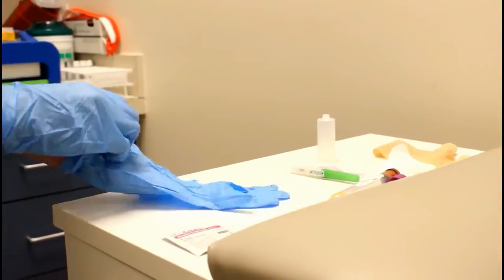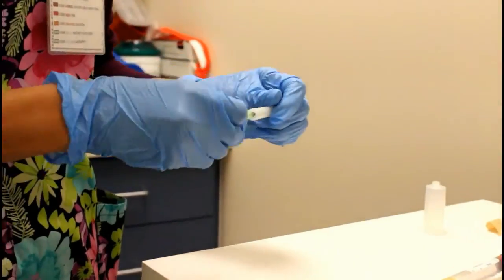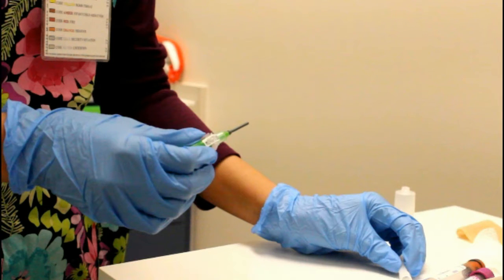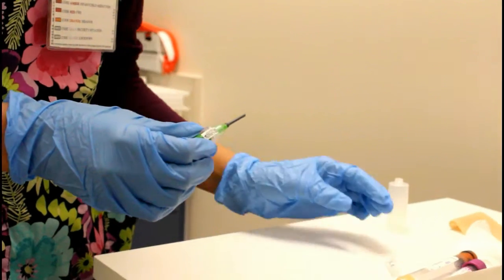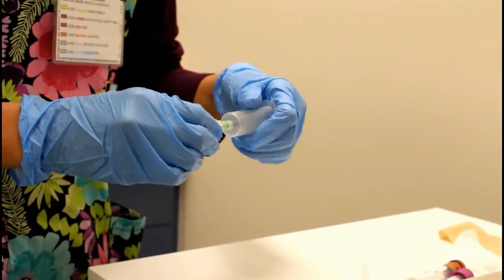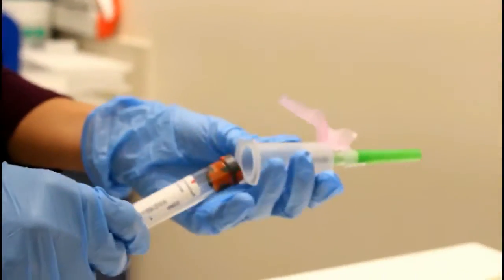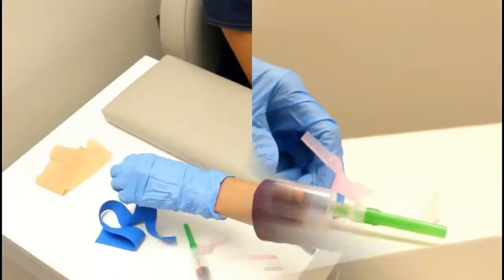Now we are ready to assemble the needle and hub. Twist and pull off the cap with the rubber-covered needle. Be careful because the outside is rubber, but underneath is a sharp needle used to poke into the vacutainer. If you push hard enough, you could stick yourself. Then screw the needle to the hub. Personally, I prefer to ready my vacutainer inside the hub, but don't puncture just yet.